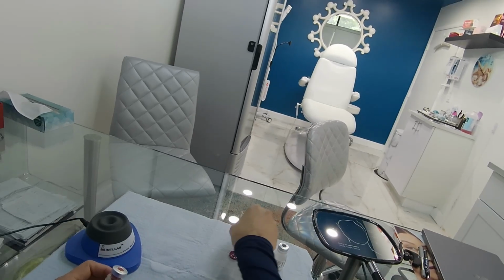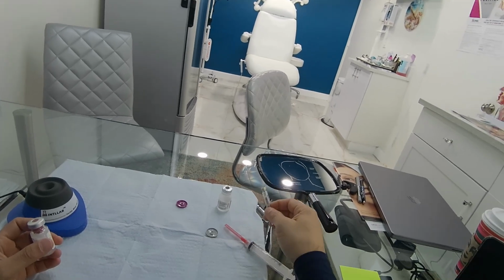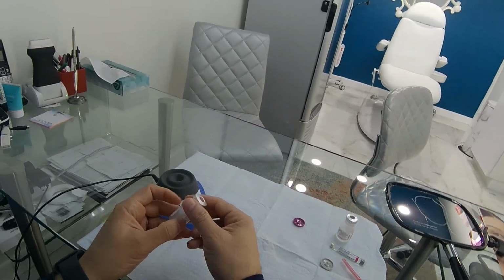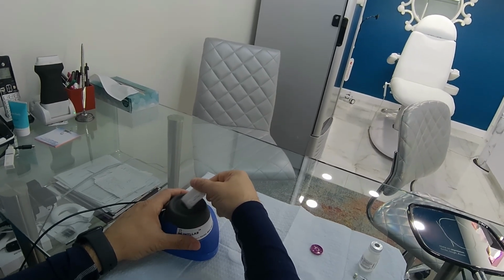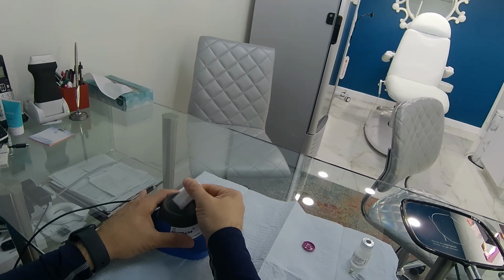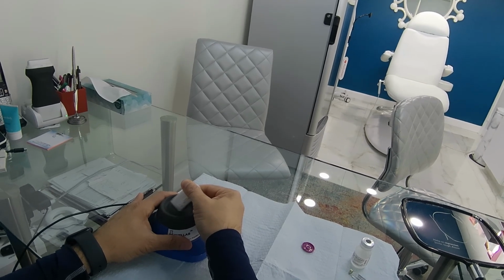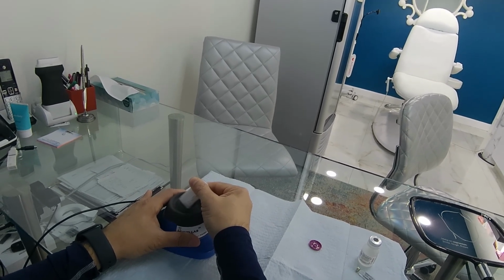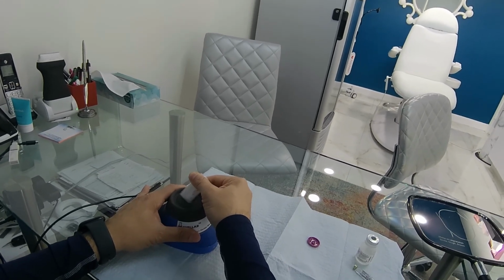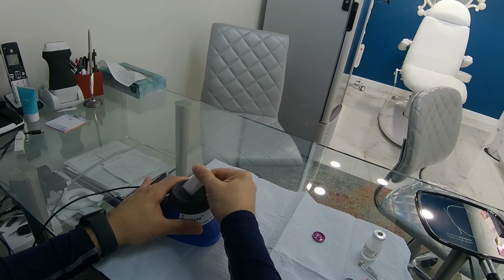So again, in the past, the lidocaine with epi, I mix like 1 cc, sometimes 2 cc. So if you do 8 cc sterile water, then you do 2 cc of this. If you make 9 cc of sterile water, you can do 1 cc of lido with epi, and then you can always go up and down. For example, if you're doing a really large volume of Sculptra, then you don't want to mix more than 1 cc of lido with epi in each syringe, and sometimes you have to go down to half a cc, especially if you're doing like 20 syringes or vials of Sculptra, so that's a lot of epi, and it starts to get into toxicity level, so you can adjust to prevent that as well.